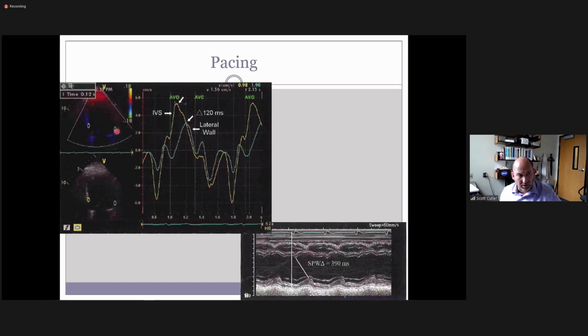Now, if I was to take a sample here and put one at the apex, they should contract at different times, because the apex should be squeezing first and then kind of pushing the blood out that way. If my basal wall is squeezed first and then pushed the other way, all the pressure and fluid then goes towards the apex, causing a possible formation of an aneurysm. So it definitely needs to contract in the right pattern, but the walls opposite of each other should contract at the same time.